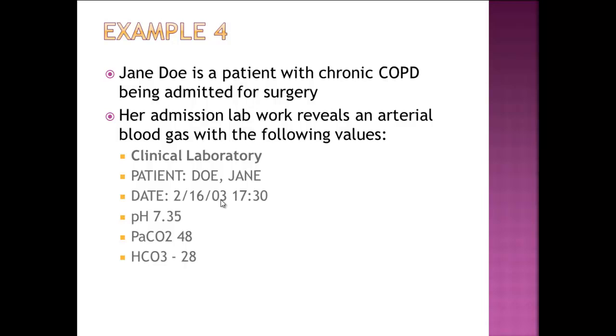Now, since the PaCO2 is elevated and the pH seems to have returned from an acidic or lowered pH state to the normal level, this most likely was a respiratory acidosis. And we can see that the bicarb is elevated, meaning that the kidneys compensated.